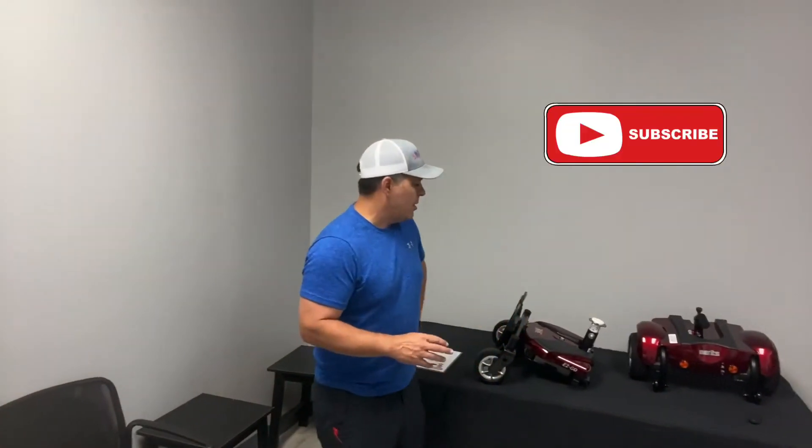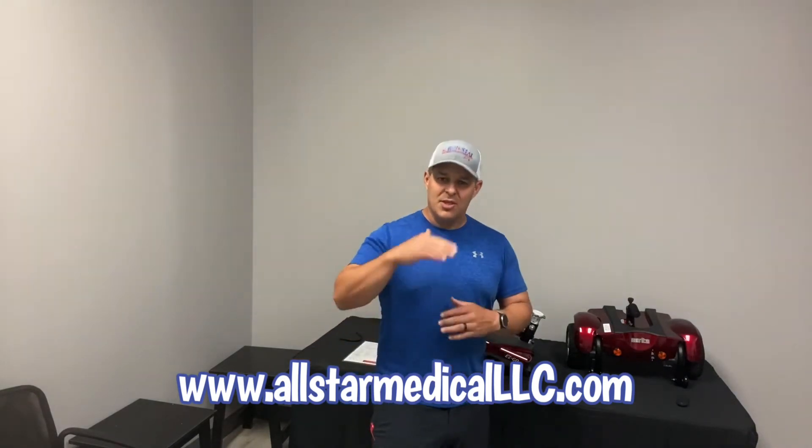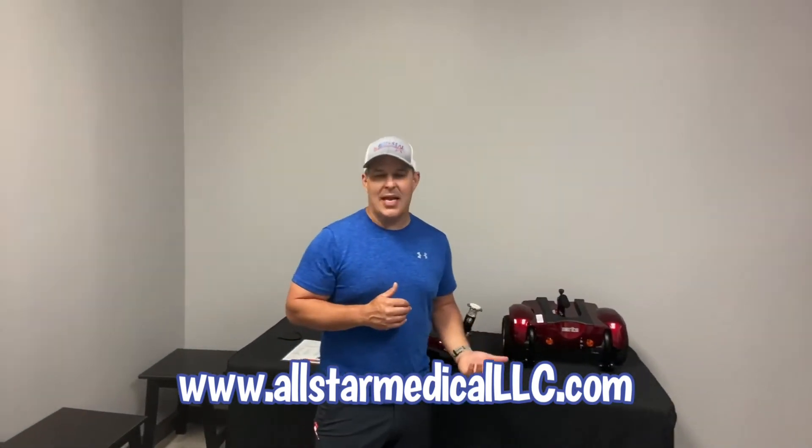It's a great little unit — 250 pound weight capacity with a lot of features and benefits that some mobility power chairs don't have. What I really like about it is that higher back, which is something you just don't see in the industry right now. It can really be beneficial — you see short backs on everything, but this one doesn't have that.